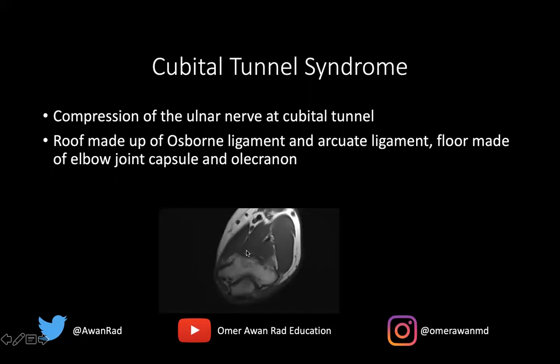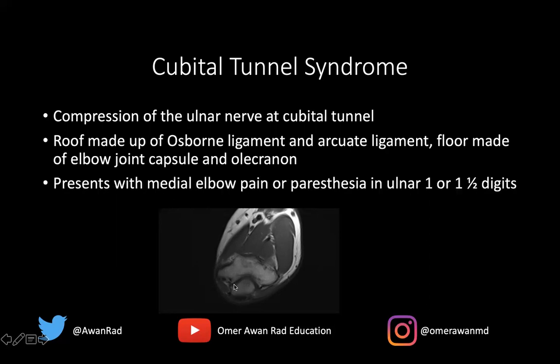Also the arcuate ligament, which is a ligament that runs between the humeral and ulnar heads of the flexor carpi ulnaris muscle. The floor is made up of the elbow joint capsule and the olecranon right here. So this is the space we're talking about — the cubital tunnel.